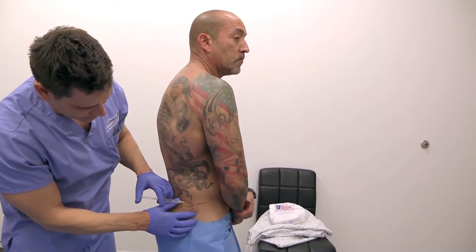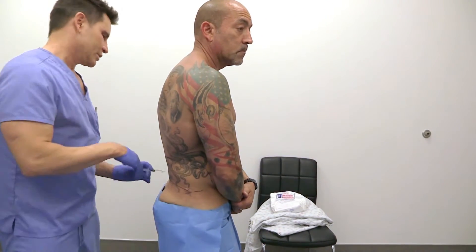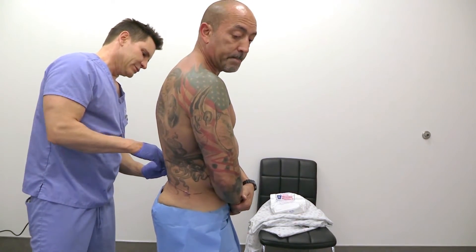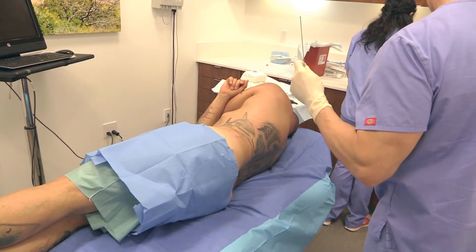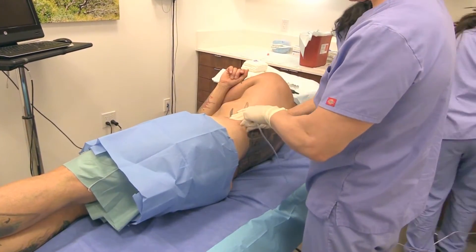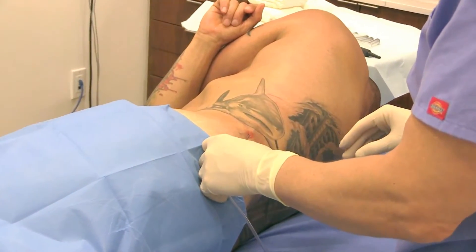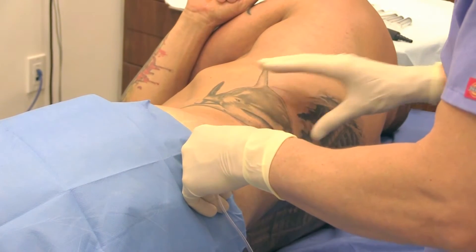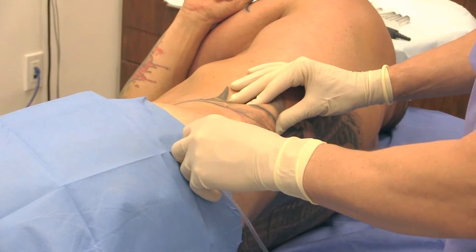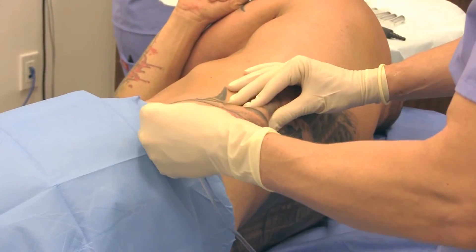So what we do is we numb up the area — a little stick, a little numbing here. Now we're just infusing the area with the solution. In the water solution we have lidocaine, which numbs up the area, and it also has a little bit of epinephrine to constrict blood vessels.